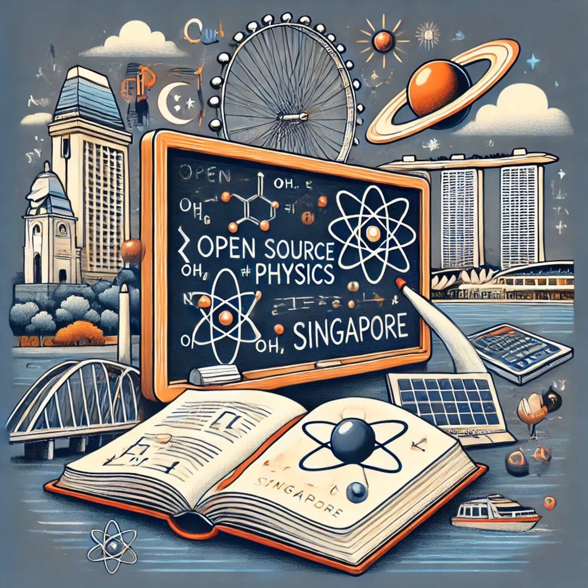That's really helpful. This simulation is amazing. I'm learning so much. I'm glad to hear that. We've covered so much already. It's really incredible how much goes into creating these X-ray images. It is. And it all starts with those basic principles we talked about. Right. Understanding how X-rays work and how to control them. Exactly. And create a clear and accurate picture. And of course, how to do it all safely. Right. Patient safety is always the top priority.